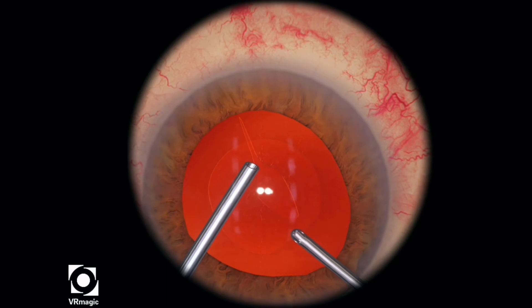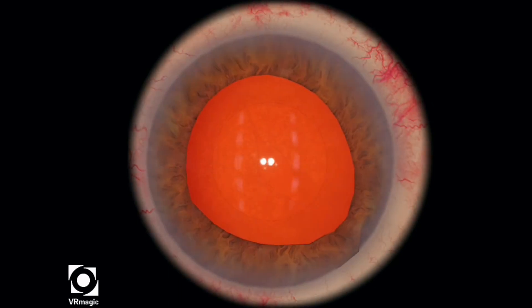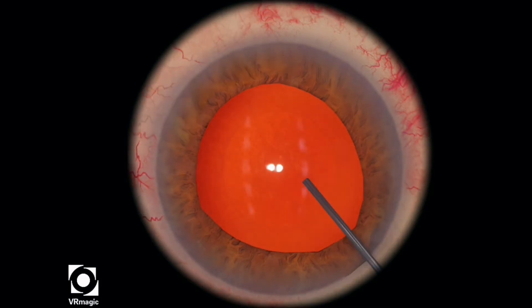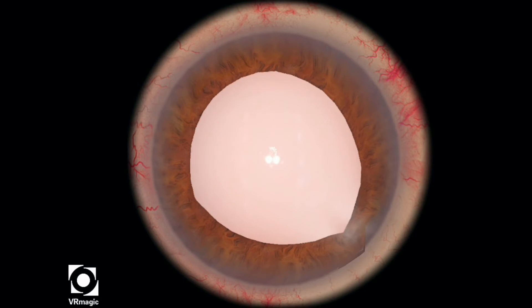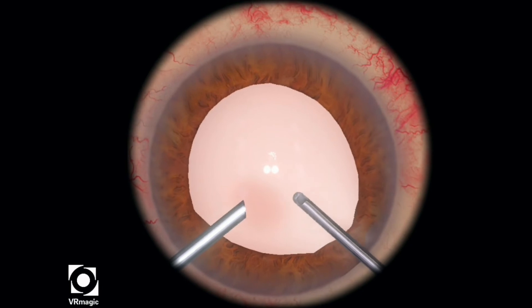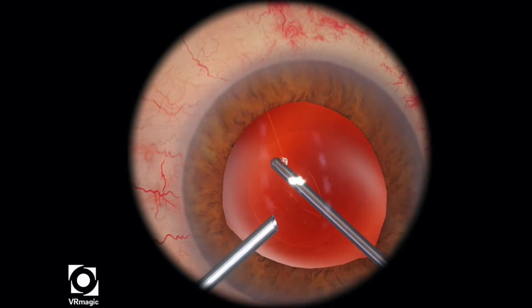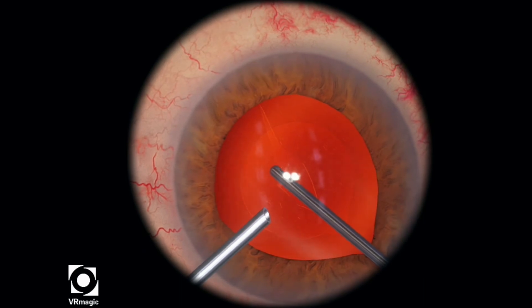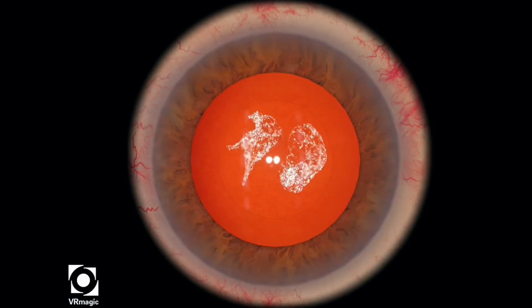So now I'm kind of going after it a little bit more. We're going to stain one more time, and now I'm actually staining deep. I'm pointing my cannula behind the posterior capsule and then getting my vitrector, trying to clean up the rest of the vitreous that's stained there. On this particular level, if you don't clean up all the posterior vitreous, you're going to lose a lot of points as well.